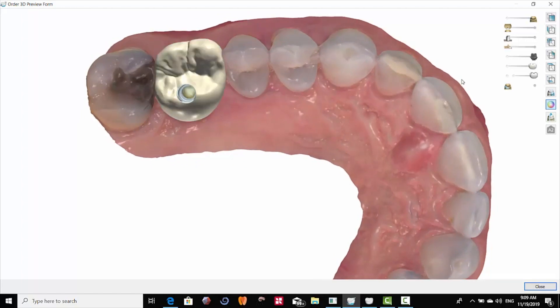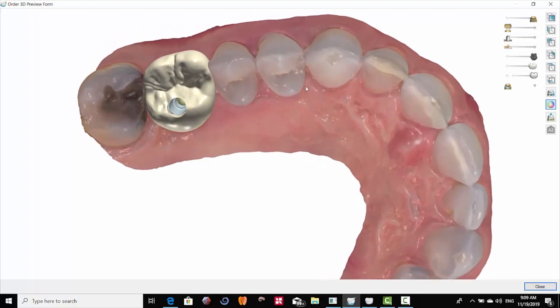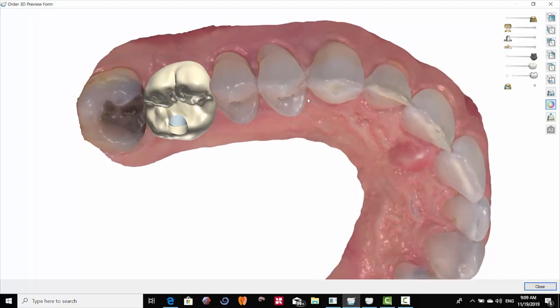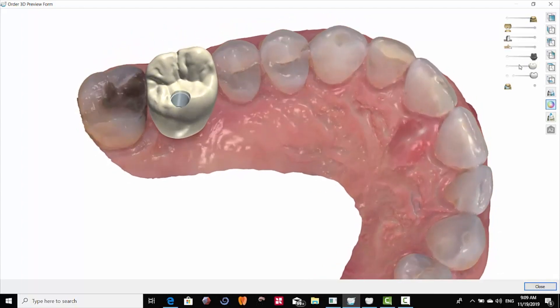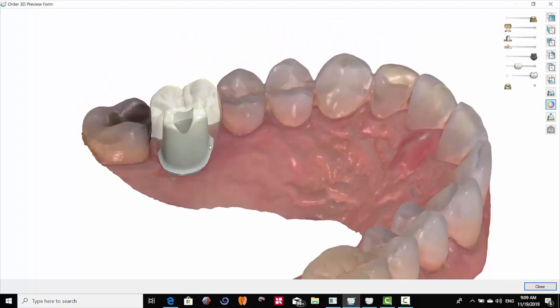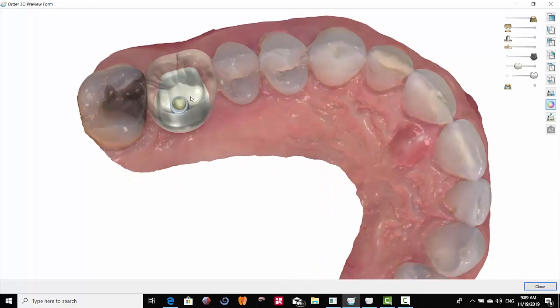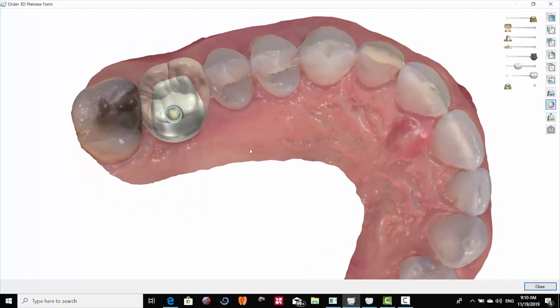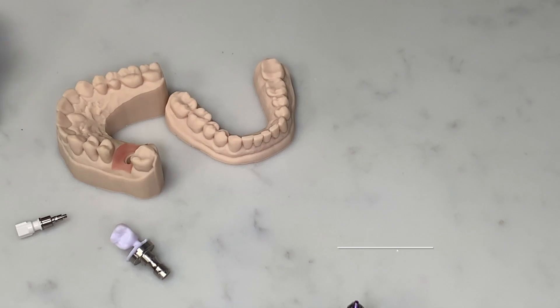Here's a crown — we're opting for a screw-mentable restoration. What a screw-mentable restoration uses is, instead of using a tie base, it uses a custom abutment. This framework is cemented on top of this, screwed down in the mouth. The cement is initially cleaned intra-orally, this is unscrewed, and then the remaining cement is cleaned up.